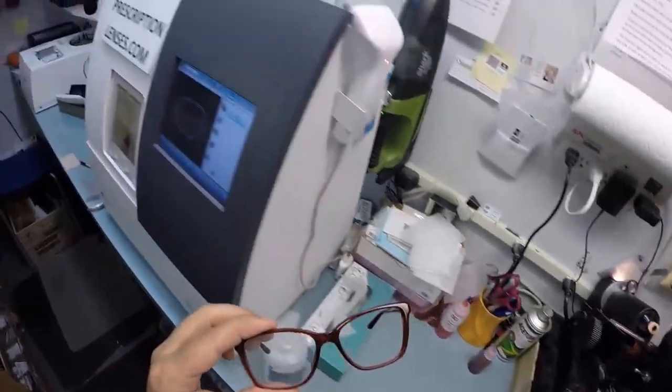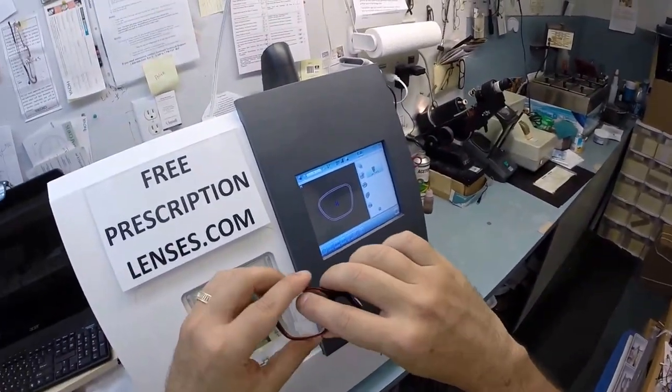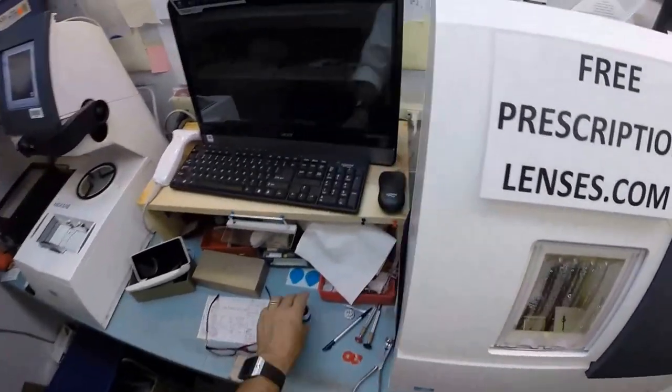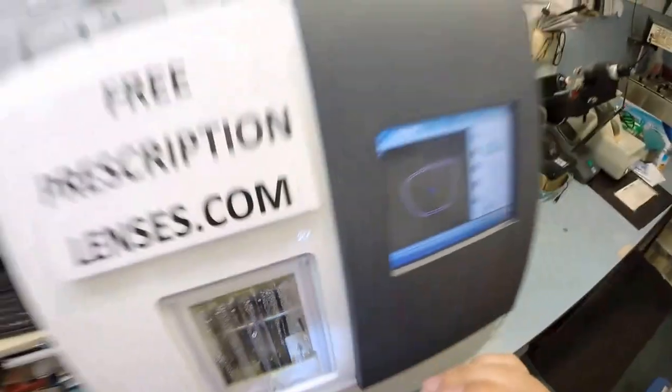Yes, when I sat for the state board exam, I would have flipped it around and read the power of the lens from the front and then read the bifocal strength from the back of the lens. For those optical nerds out there who know that's the proper way to read a bifocal. But for everyone else watching, don't worry, I got this.